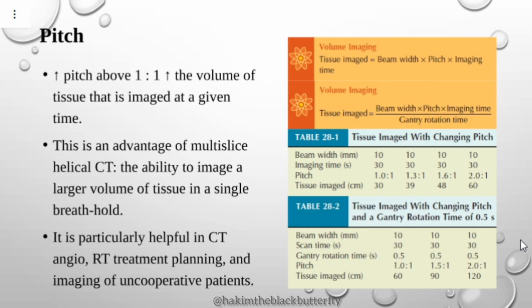Breathe in and hold your breath. The patient has to be in a position to breathe in and hold the breath until the entire examination is complete. Forget about chest X-ray, whereby in just milliseconds the image is taken. CT takes seconds. It can even take like 15 seconds just scanning to complete the entire length that you have commanded it to scan.